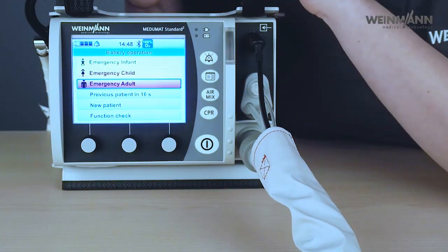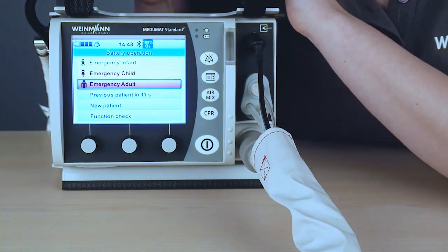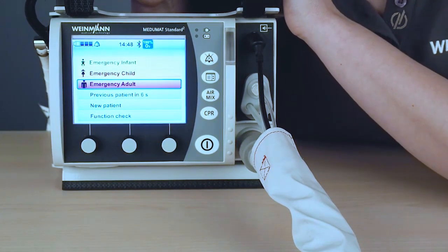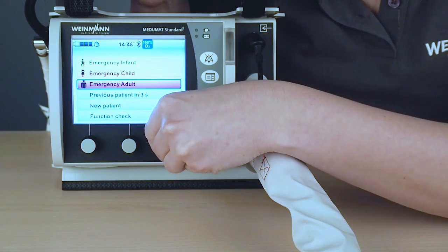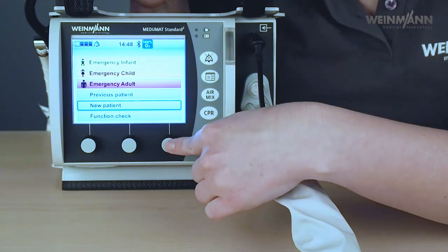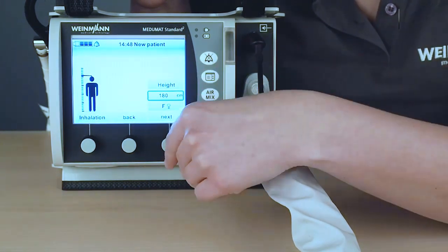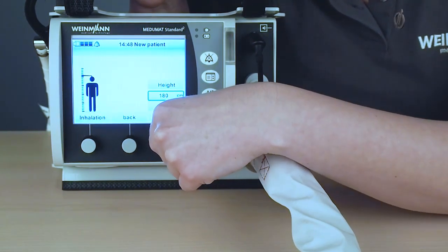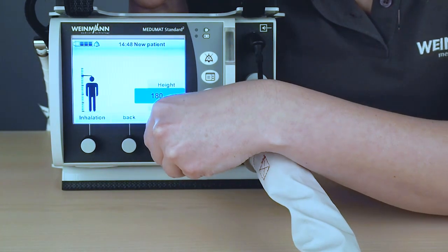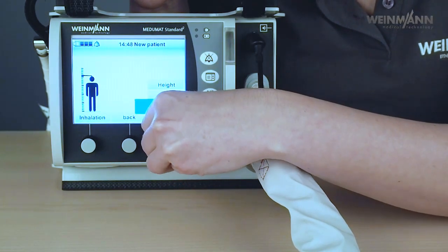Besides the emergency modes, you have 2 different ways to enter ventilation. One of them is the previous patient, which will automatically start after 15 seconds when you switch on and off the device quickly. I won't do that right now. The other way is via new patient. So here you have the possibility to make a bit more specific settings depending on the patient. So I will set new patient. Here you have the possibility to enter the height of the patient and the sex. So first of all, I will enter my height, 175, and my patient is male.